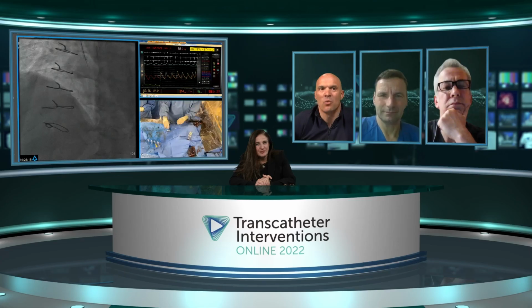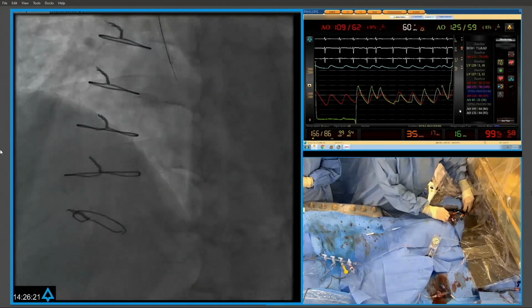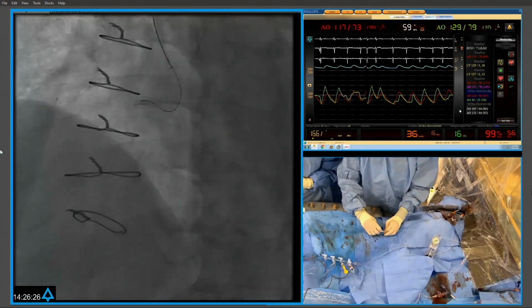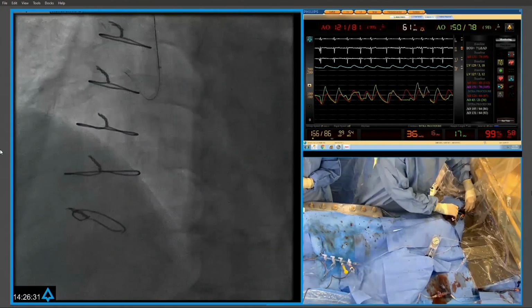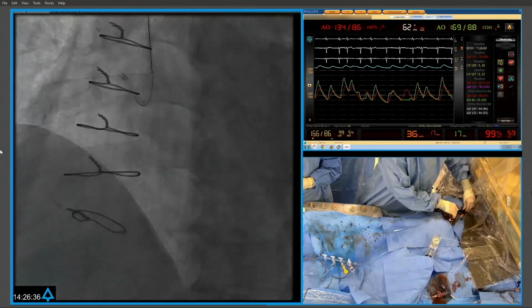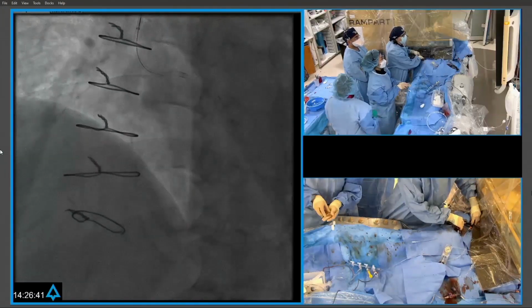Nicholas, while Nicholas is talking, if you can just show us the angio so we can see what they're doing. Nicholas? I think what you also nicely see is the difference in quality of the diagnostic angio and the angios that you make as an operator, as an interventional cardiologist about to embark on a complex procedure. Oftentimes, the quality of the angios becomes much better. So I think it really changed the mindset up front.